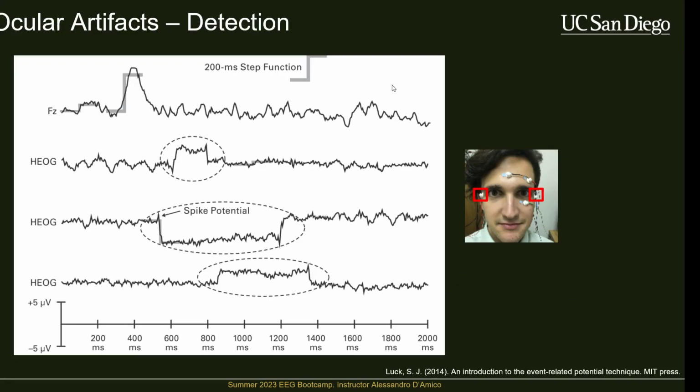So, different ocular artifacts. This is an example. We're looking at FZ, which is an electrode right here, pretty frontal. We're looking at our HEOG, which stands for horizontal EOG, electrooculogram. And these are going to be the electrodes that are on the sides of the eyes. So this will be your HEOG. Whenever you're moving, and actually, I don't know why, I think these are all different examples of HEOG things.